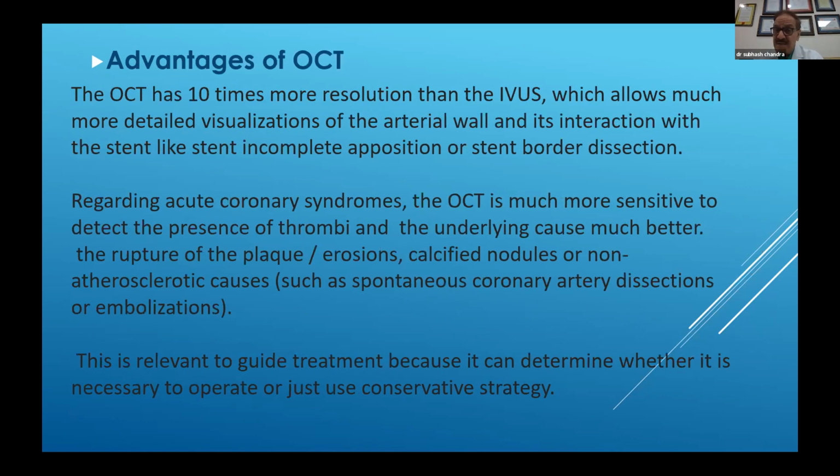These are the advantages of OCT. Suffice to say that it is 10 times more resolved and the resolution is much better. However, it is compromised by its penetration, which is much better by the IVUS.